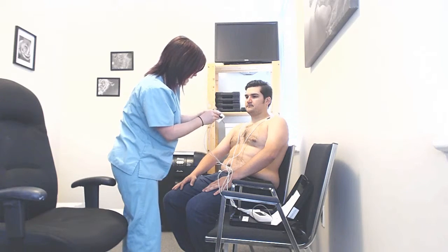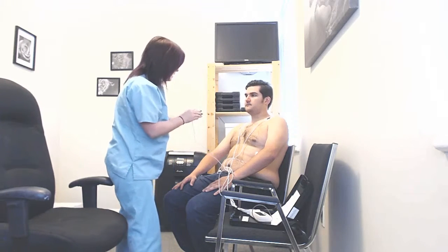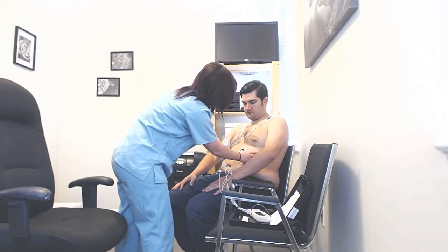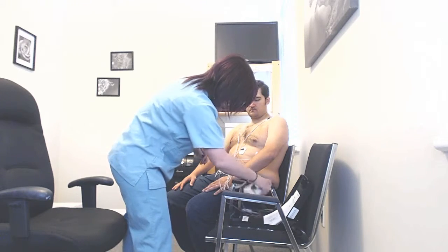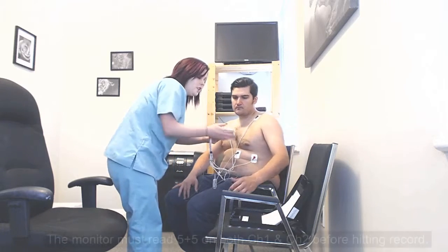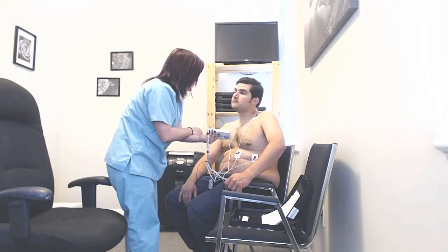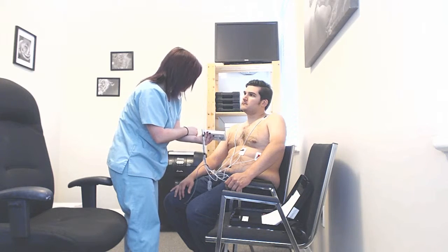I normally find this happens in patients when they wake up in the night — make sure the leads are still attached, and if not, attach them back right away. We put one down by your ribs, and then this brown one is a little off center from the red one. The readings on channel one and two say five plus five, which means that we have proper placement of all the electrodes. If those said any other number, we'd have to reposition until that reading came up.